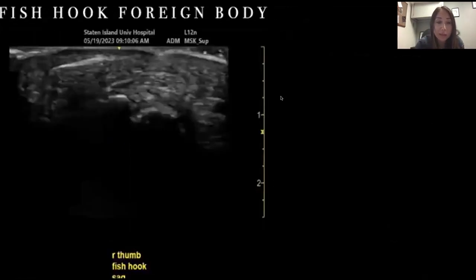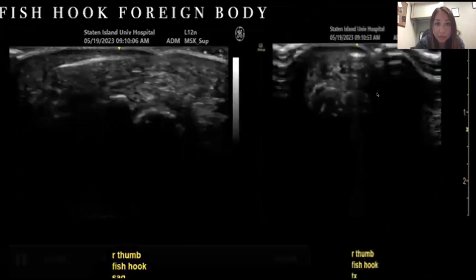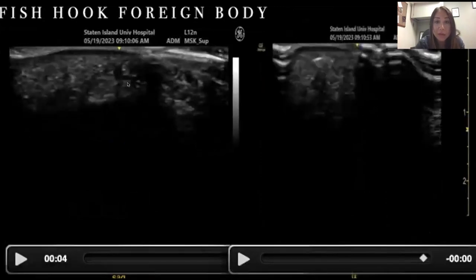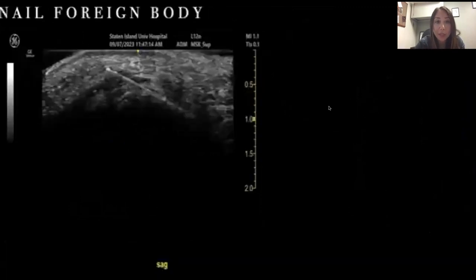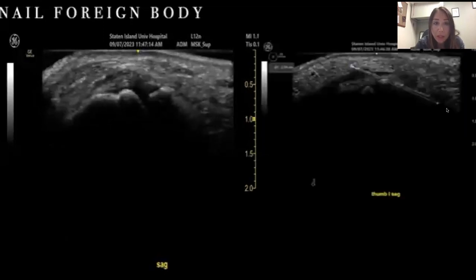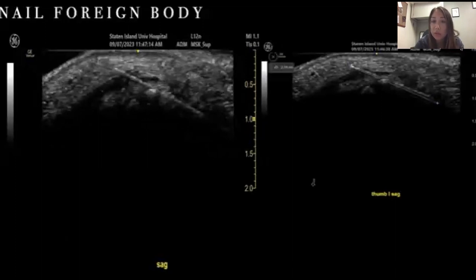Here are more foreign body examples. A fish hook embedded in a patient's thumb — the bright hyperechoic area is the fish hook; it's easier to see in sagittal than transverse. A nail foreign body in the hand — you can make out the entire nail as that bright hyperechoic structure, and when measured it was about two centimeters. We used ultrasound to guide both diagnosis and removal of the foreign body.